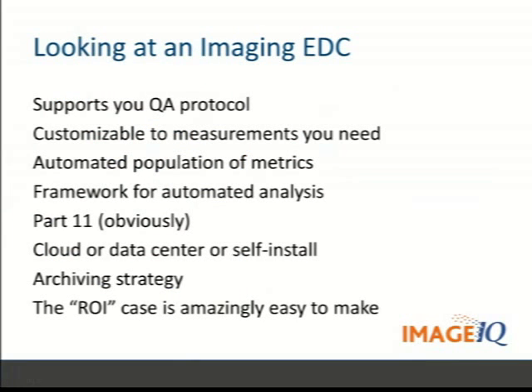Look, if you're looking for an imaging EDC and you start thinking about all the efficiencies this can bring you, there's a bunch of stuff you got to think about. You need to make sure it supports a QA protocol. You need to make sure it's customizable to the measurements you need. Like you said, we didn't get to talk about it a lot, but the order in which you assess those images and do those measurements is important for consistency.